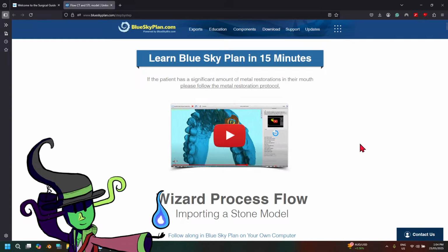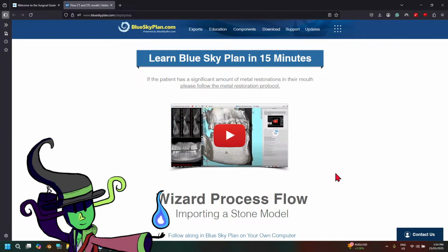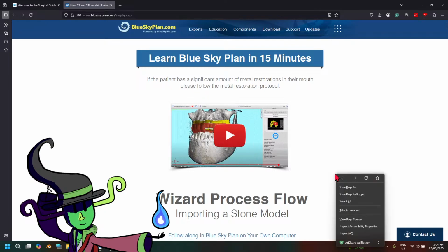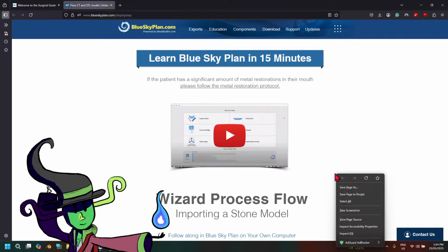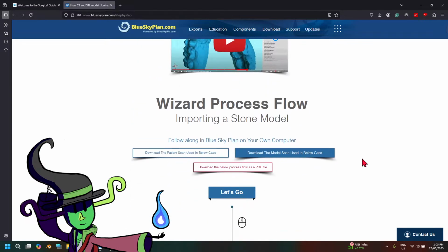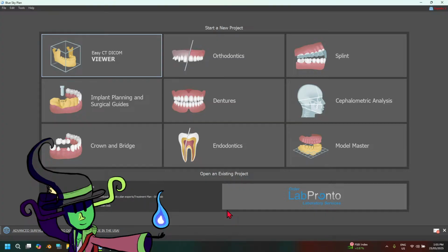Okay, so you guys might be wondering, how do I get into dental CAD, specifically Blue Sky Plan? Well, I've attended a bunch of instructors' seminars in the past, and most of them tell me to just go watch a YouTube tutorial, or if the CAD software has a website, you can go into the website, and most probably they'll have a list of documents for you to read in order to study these dental CAD software.